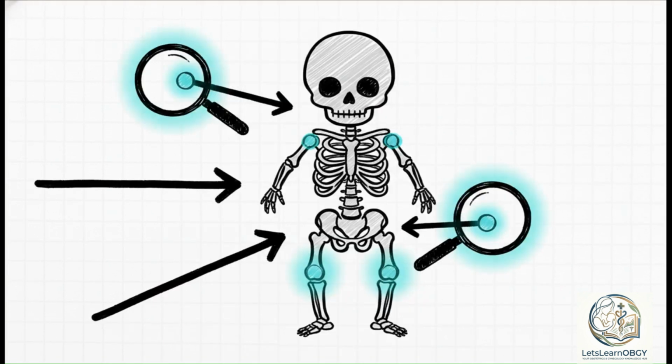Now, every now and then, you're going to have a patient come in late in the third trimester with zero prenatal care and no prior ultrasounds. It happens. While we can't use these for exact biometric mathematical calculations, there are some really helpful non-biometric skeletal milestones you can look for to help estimate fetal maturity. For instance, the femoral epiphyseal ossification center usually becomes well visualized right around 32 weeks, and the proximal tibial ossification center by 35 weeks. Seeing the proximal humeral epiphyses suggests we are safely in the late third trimester, which, by the way, correlates really nicely with fetal lung maturity.